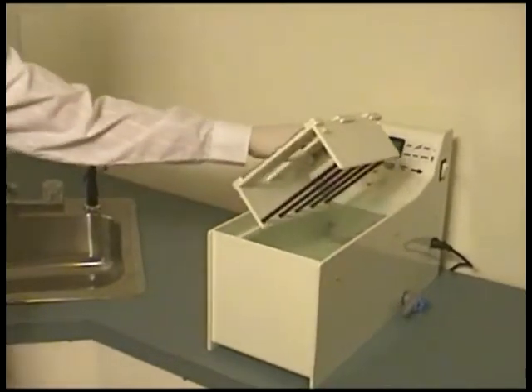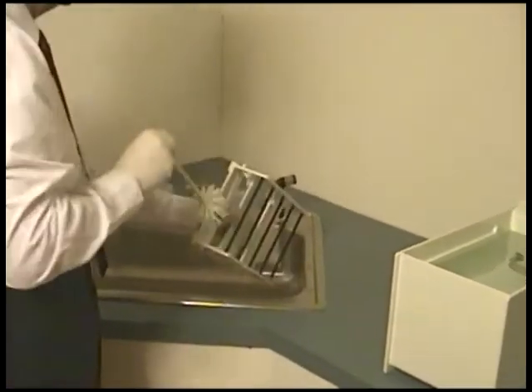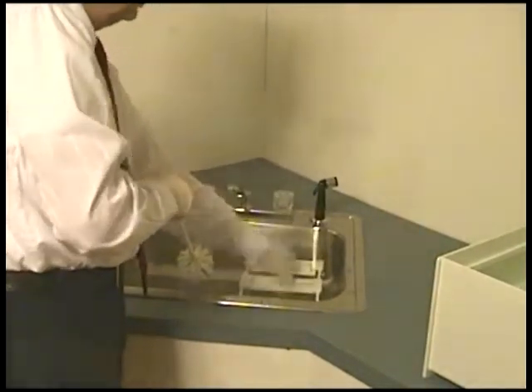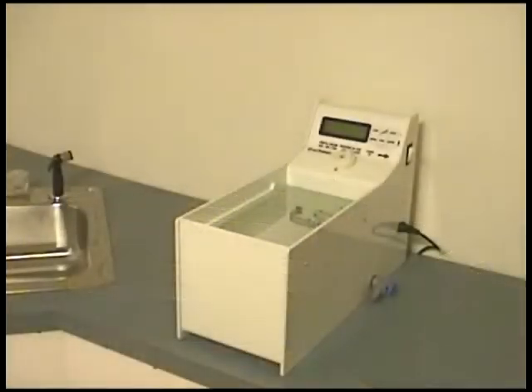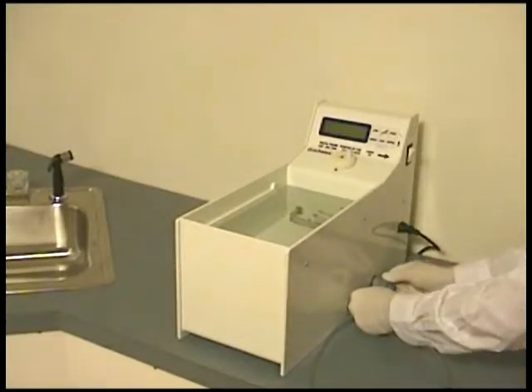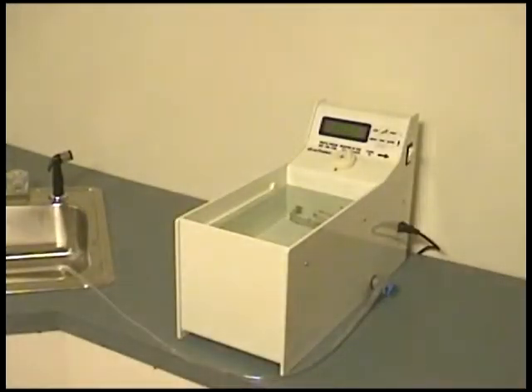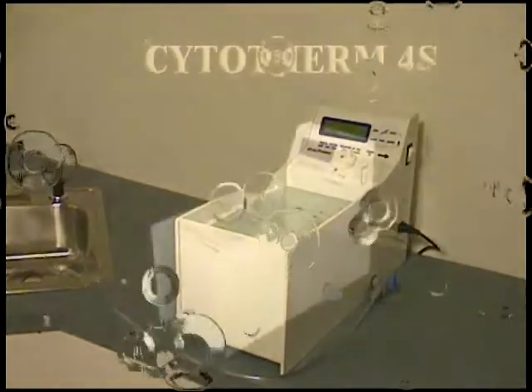Cleaning the bath is easy. Turn the unit off, remove the rack, and carry it to the sink for cleaning. Connect the drain tubing to the drain valve, and place the other end in a bucket or sink. Turn the handle of the drain valve clockwise. The bath will drain completely. Close the drain valve, then pour clean water inside the bath and clean all the exposed parts. Let the water drain out again.